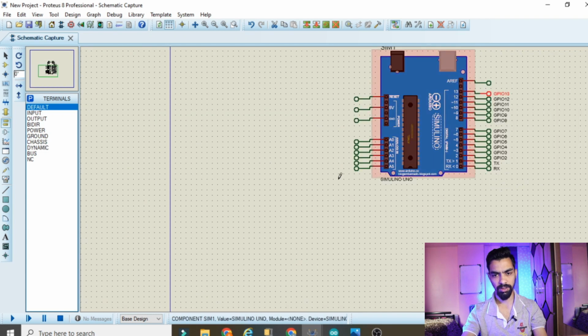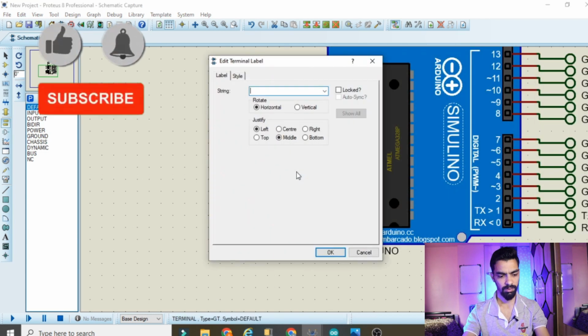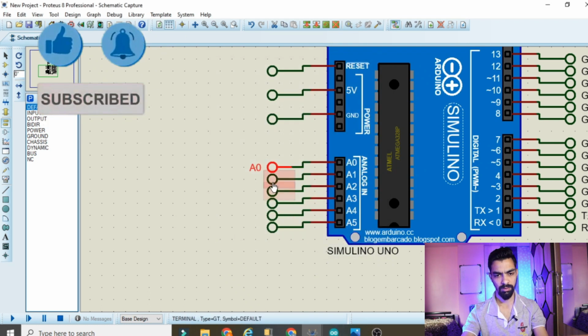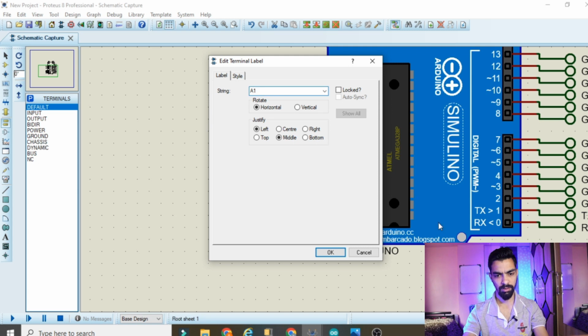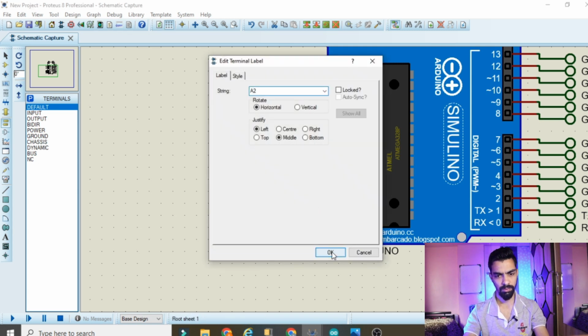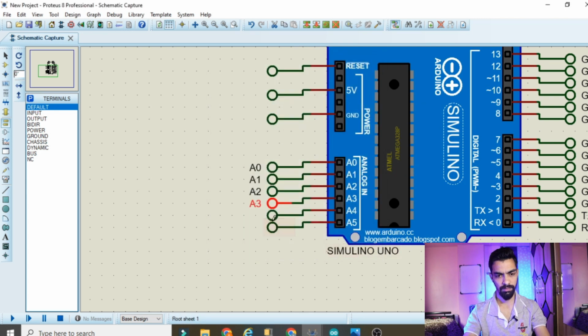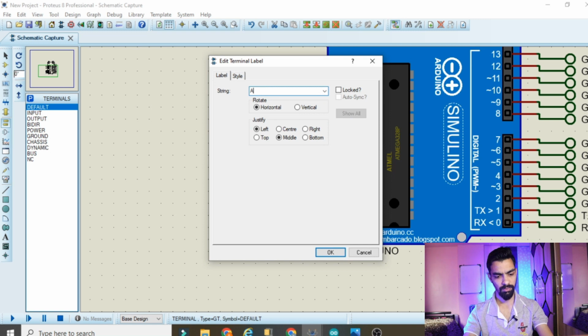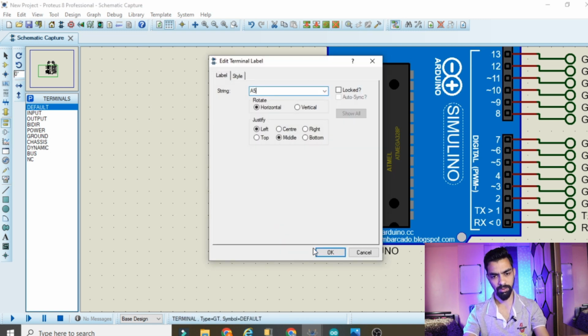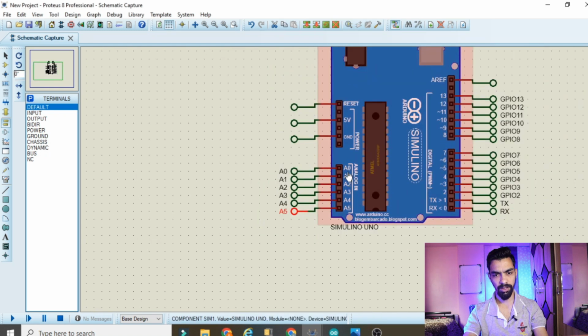Then here you can see in the same way A0, A1, A2, A3, A4 and A5. Okay, we have completed this one.